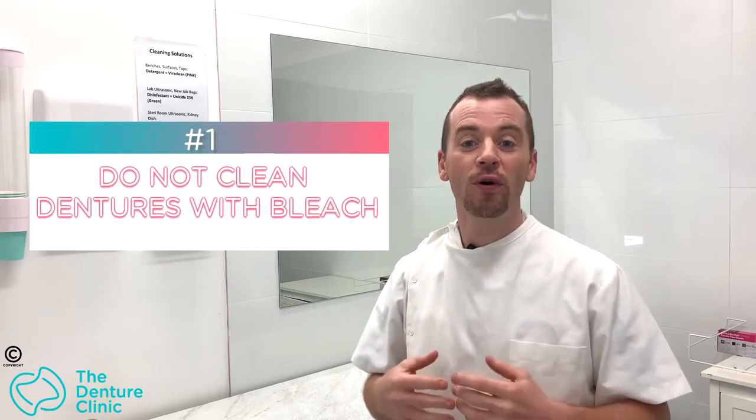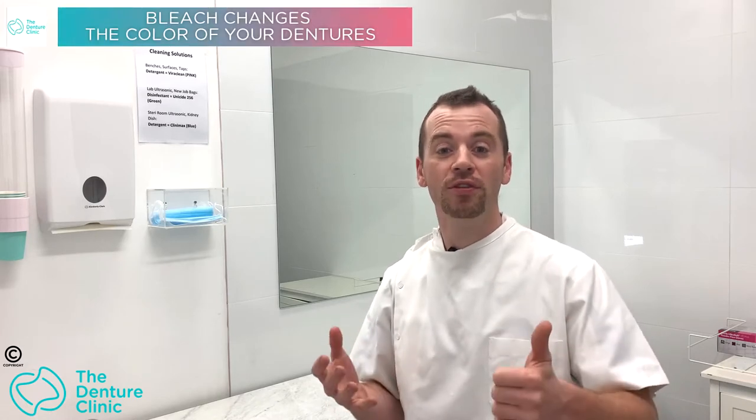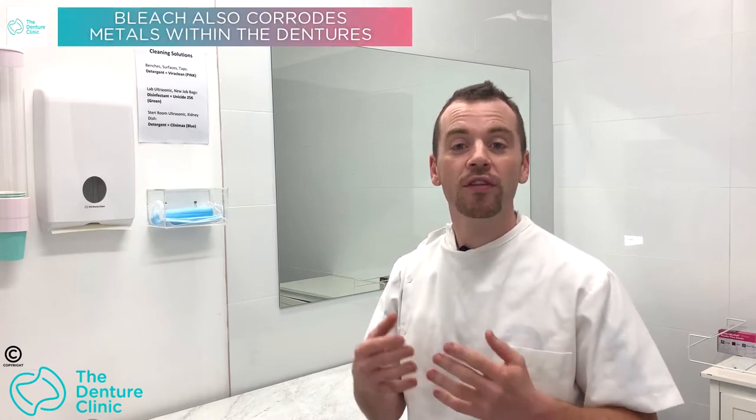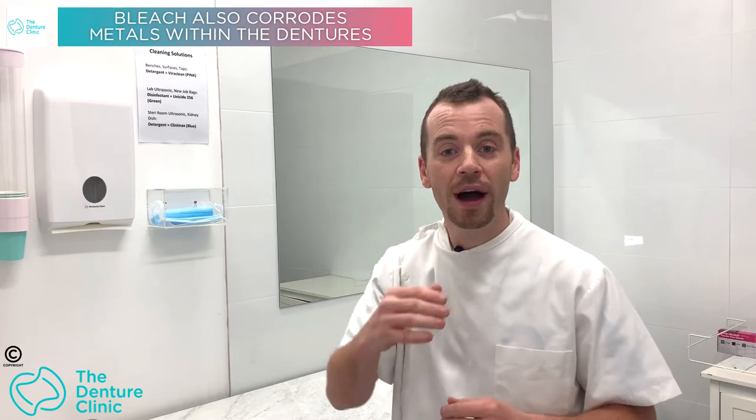It's an old wives' tale that's been around for decades, but cleaning your denture with bleach is not ideal. Dentures are not designed to be cleaned with such a harsh chemical. Cleaning with bleach will actually change the color of the material, and the chlorine inside the bleach can rust the metal components — such as the metal bars and clips that hold onto your teeth. So the first tip is: don't use bleach.